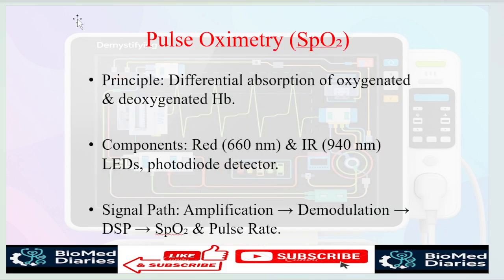So another is the pulse oximeter. This was a very hot topic, SpO2, during COVID. Most people use SpO2 in short form, like pulse oximeter.